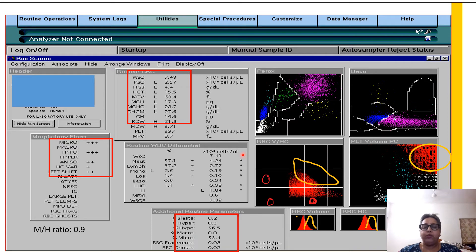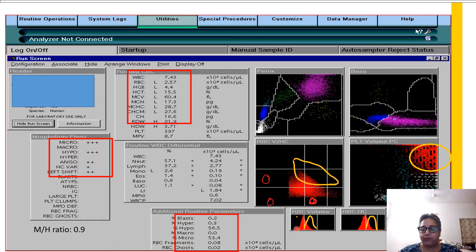I would request you not to look at the numbers for now. Let's just focus on primarily the RBC erythrogram and the two RBC histograms. What I have put in yellow here is the normal MCV or the RBC volume histogram. You can see that the histogram is shifted to the left, which means that the cells are microcytic. Similarly, this is the normochromic red cell, and a shift to the left means there is hypochromasia. So you have microcytosis and hypochromasia.